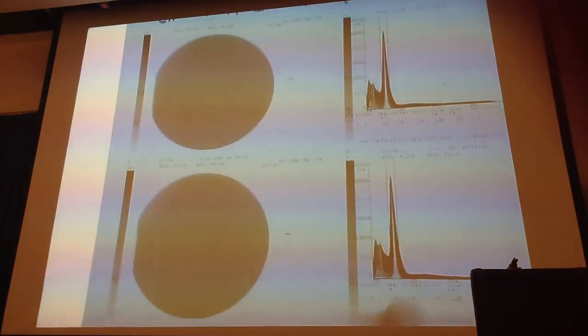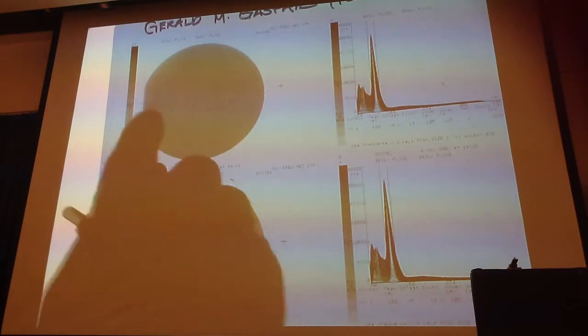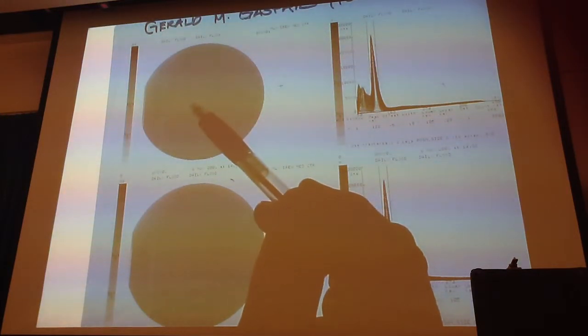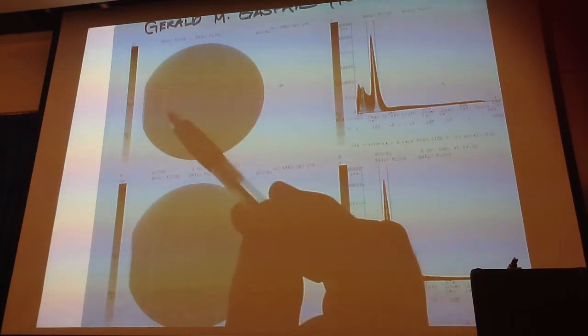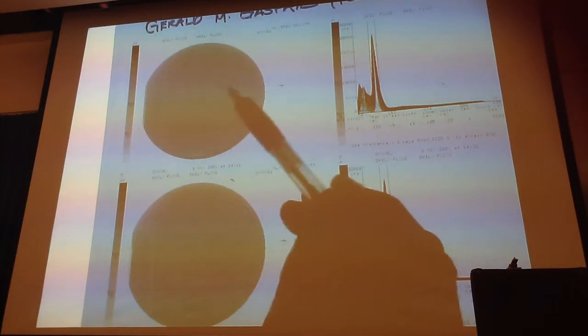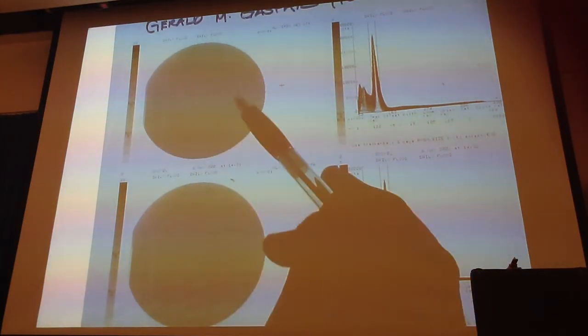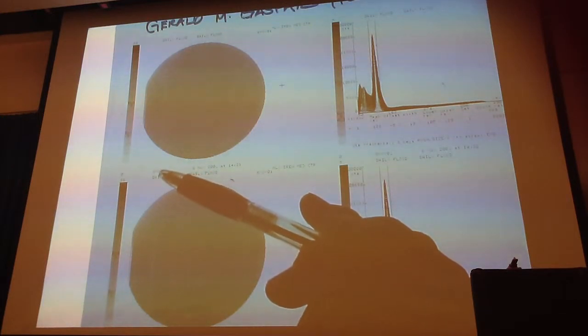Okay, but that's the reason why, is because there's 3 amplifiers. You have one for the X signal, one for the Y signal, and one for the Z signal. If the Z signal was acting up, this thing would be like a little tiny dot. With the X and the Y, either this thing will be foreshortened or elongated like it is here. Okay? But you guys have to look at these.